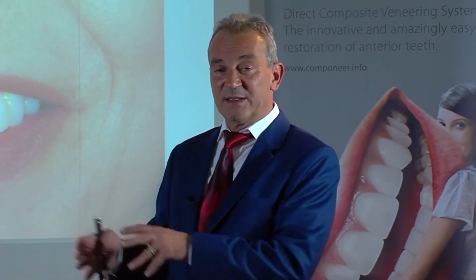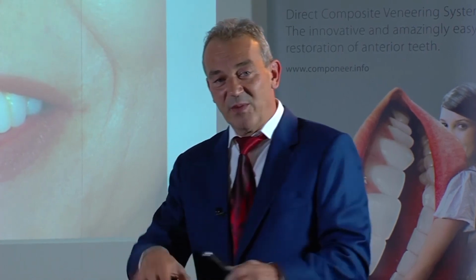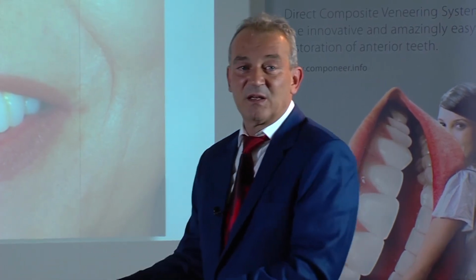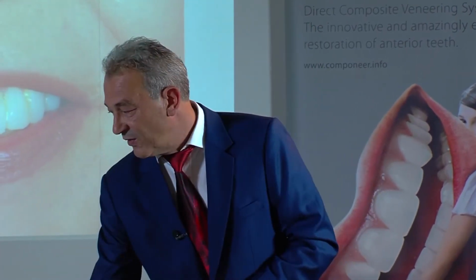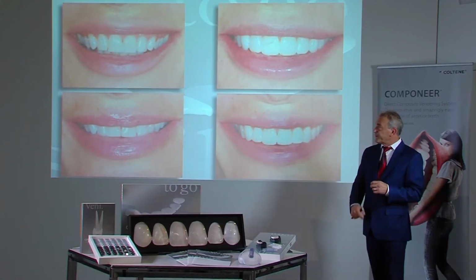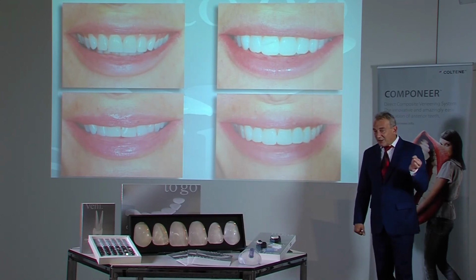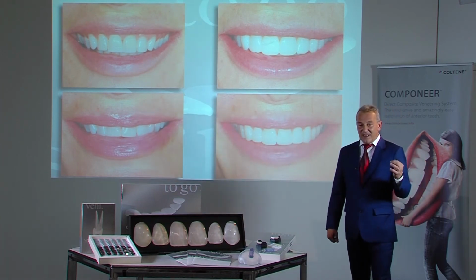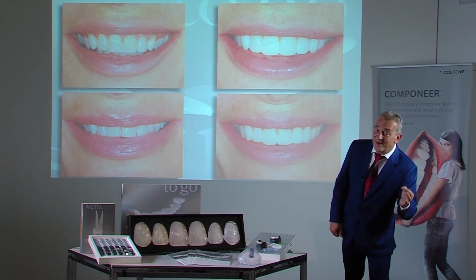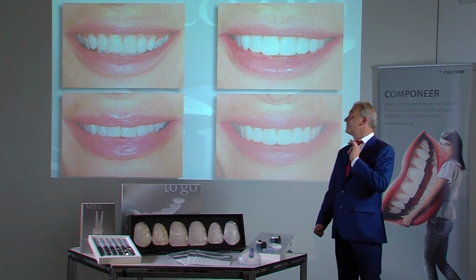An optical trick was created. The base in the background was corrected slightly using a synthetic material and for placing the componeers. Componeers can be a slight challenge, but at the same time are able to achieve something which would normally be very difficult.